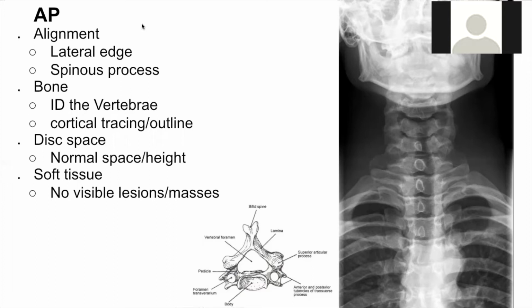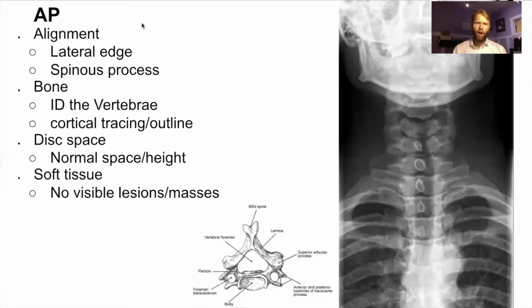Any questions, Max? No, I think it's just a really good point that whenever you get an X-ray of bony anatomy, you want to make sure that you're not ignoring the soft tissue or other structures that you might incidentally catch. I think everybody begins to have a story about how they've caught some pathology, usually cancer, from a more careful, methodical read of a whole X-ray.